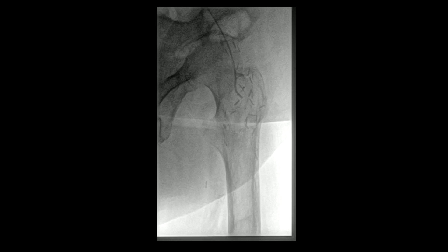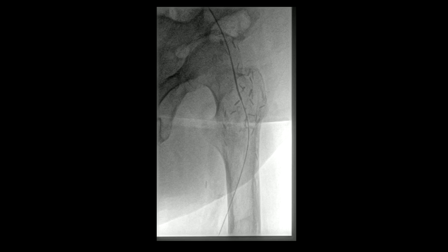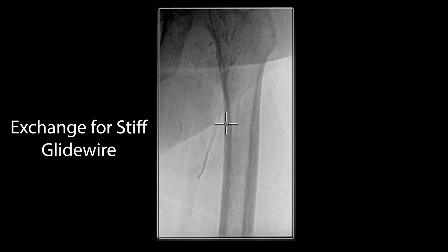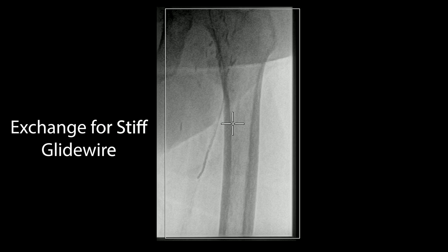We've decided to go ahead and treat this, so we need to put a sheath up and over. To do that we'll use the pre-existing catheter to place a stiffer wire — in this case still the floppy glide wire — down the bypass. We then track the catheter over it; this is called a wire exchange. Now we use a much stiffer wire, largely protected by the catheter. As you follow it down, make sure it doesn't go into side branches or get hung up.